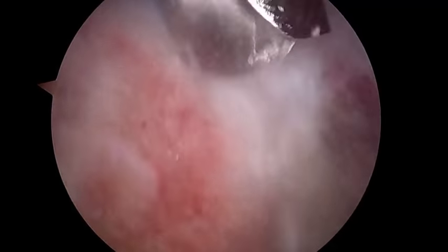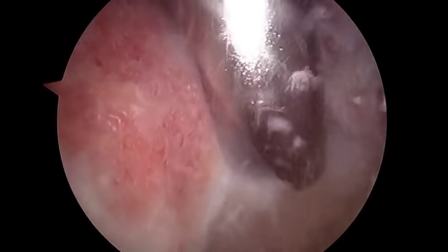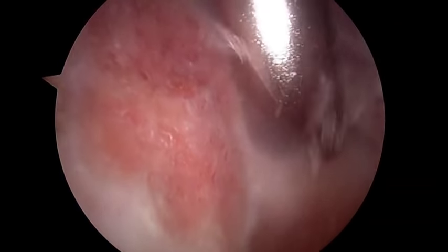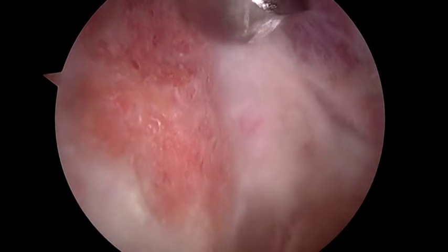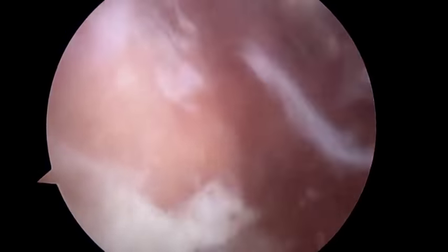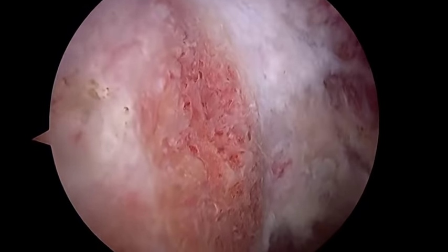This is what we call an acromioplasty. We don't always do this, but she's had previous surgery and they've done some of this before, and I just want to make sure that it's not going to interfere with her recovery. Any sharp edges that we might have here. So we've kind of smoothed out the front of the acromion.